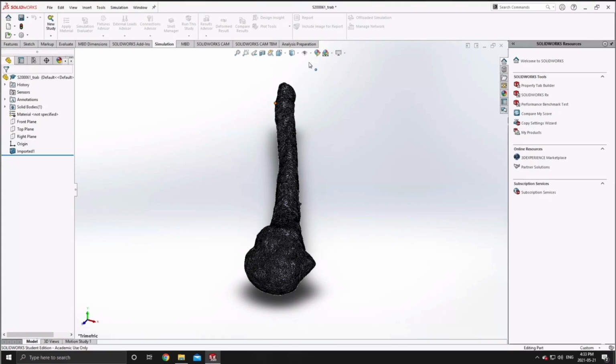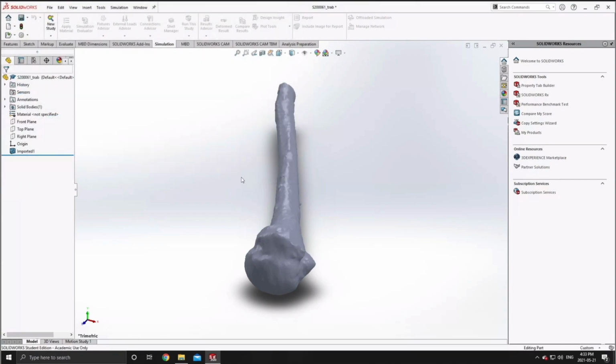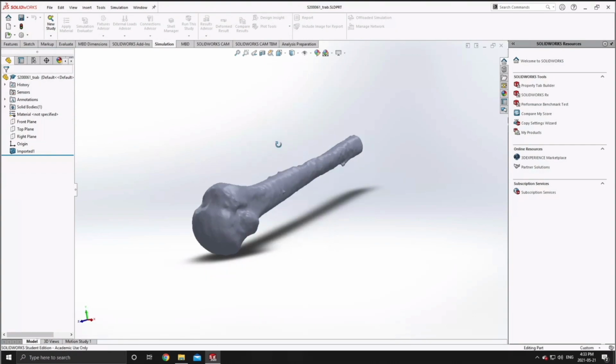After SolidWorks finishes processing your first bone model, just make sure to save it under your naming convention, and I actually would generally suggest that you exit out of SolidWorks and reopen in order to start parsing and processing your next bone model.